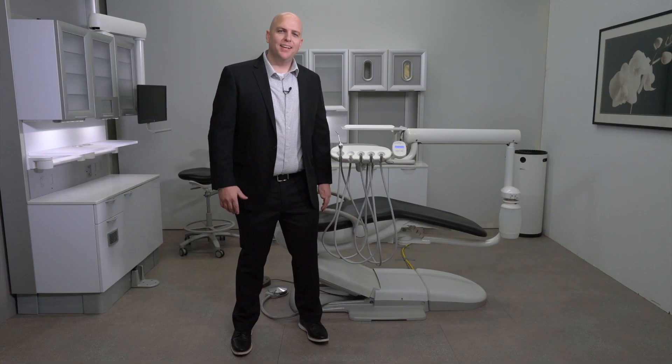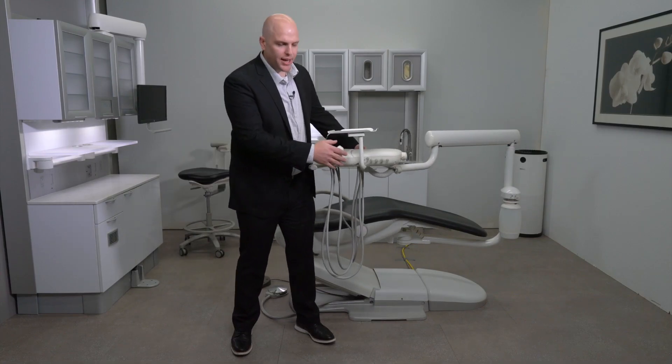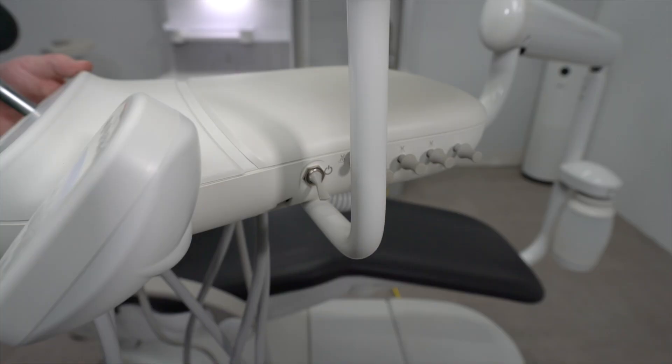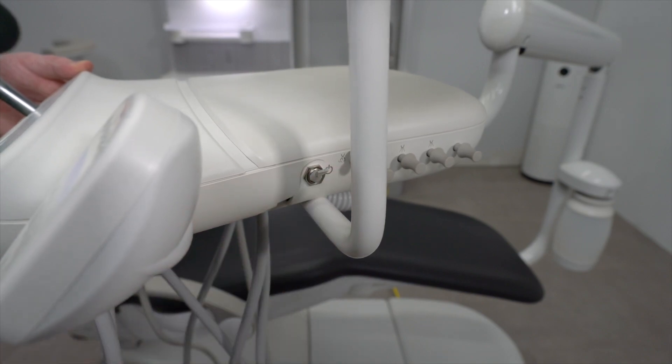Now let's talk about the delivery system. Let's begin by turning the unit on. You can find on the side of the unit a toggle switch — that toggle switch is the master power switch. Simply turn the unit on by flipping that switch up.